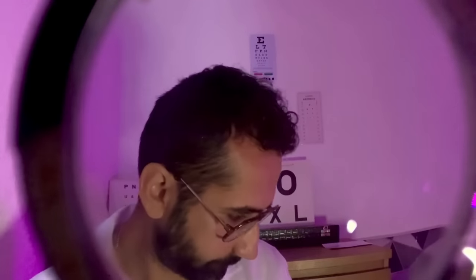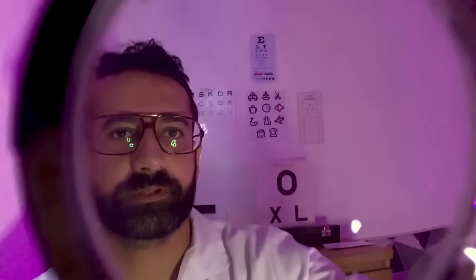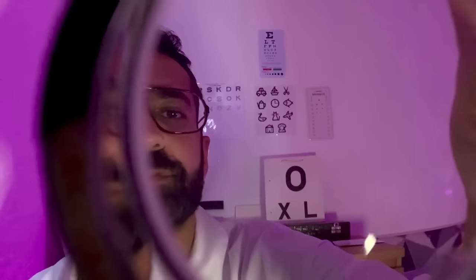There we go. And again — with the lens, without, or about the same? Okay, so I'm just going to reduce the power there, as we've gone a little bit too far with the minus prescription. We'll come back down to a minus five diopter sphere — excellent.